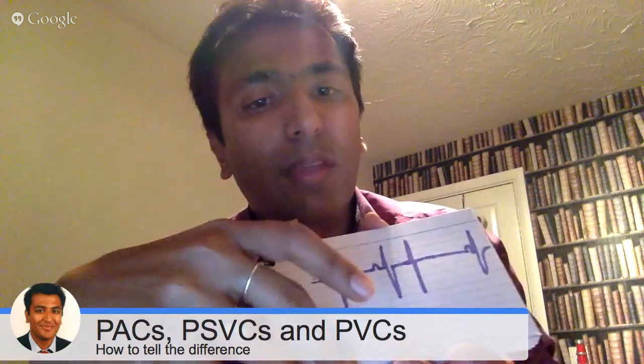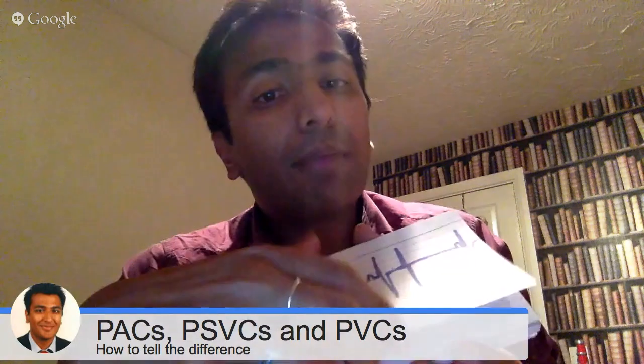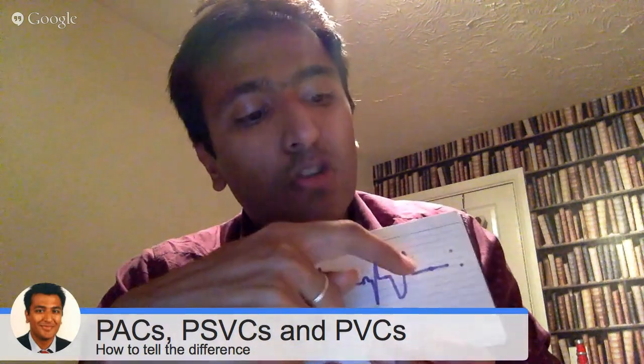Further down, if the impulse is coming from the ventricle, then it becomes much broader. And here we go, there is another one. Now here, you've got a normal P wave, and look at this. This is so broad, so much broader than this, okay? And when you see that it's so broad, you know that that impulse has come from the ventricle.